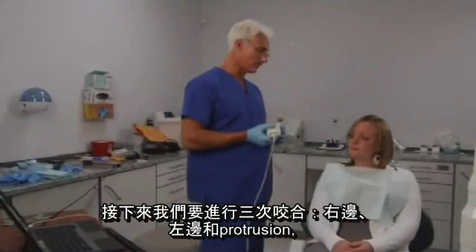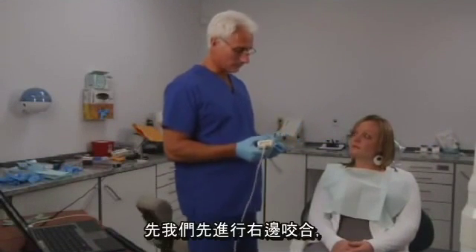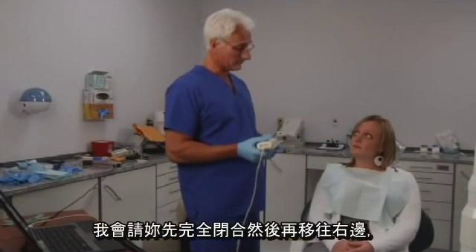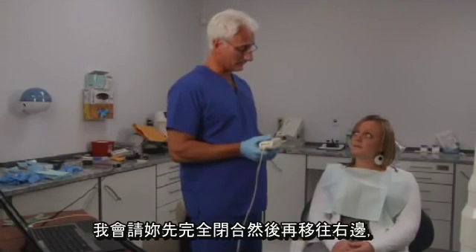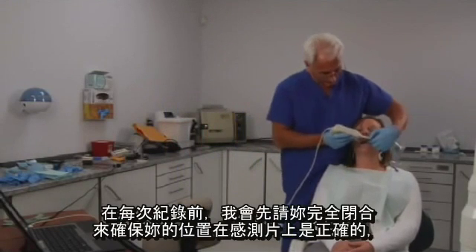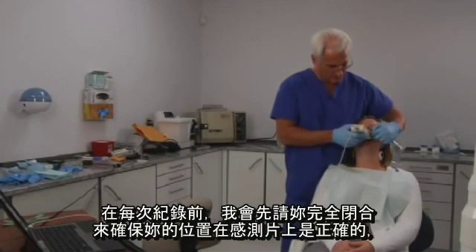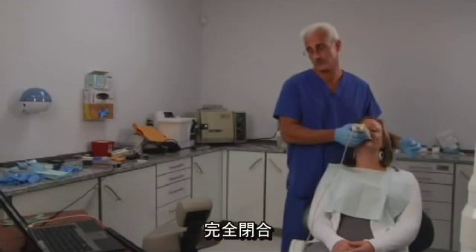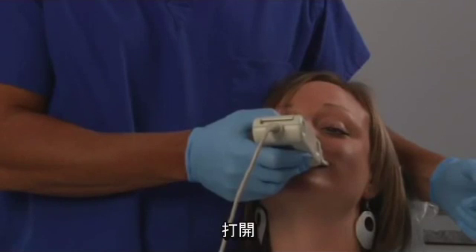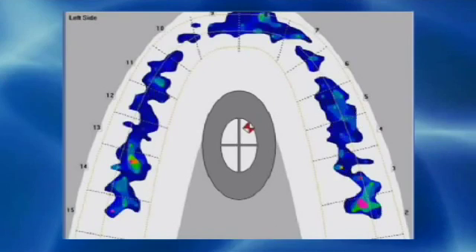Okay, so now we're going to record your 3 excursions, right, left, and protrusion. So we're going to do the right one first. So I'm going to have you bite down through the sensor, hold your teeth together, and then slide to the right. Okay? Put your head back for me. And each time, before I record, I'm going to have you close fully into the sensor to make sure you're seating your bite correctly. Go ahead and bite down firmly. And open. Bite down again. Now slide to the right.